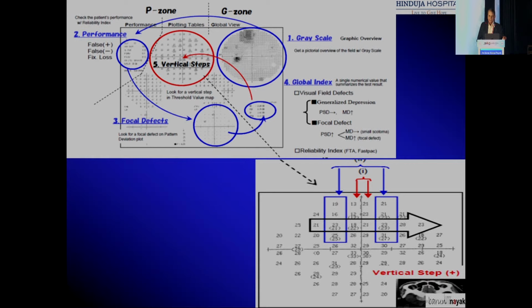Now, what does this show? If the perimetry looks normal, then before declaring it an absolutely normal field, always try to check the vertical meridian, the decibel value. This is the only time I recommend that you read the decibel value. Compare the decibel values of the points just next to the vertical meridian. If three or more consecutive points show unidirectional depression, then move to the next column after that.